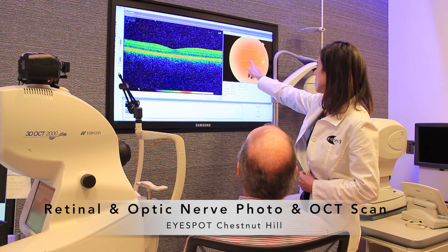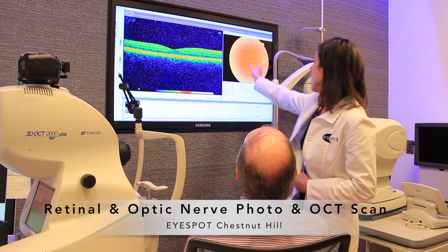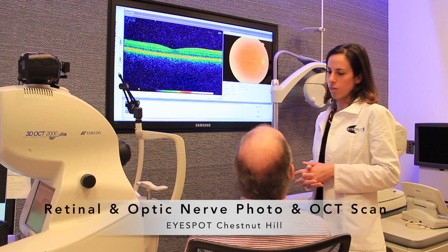If you look at the center of your eye, that's your macula, or where you get your very best vision. The retina and everything in that photograph looks nice and healthy.